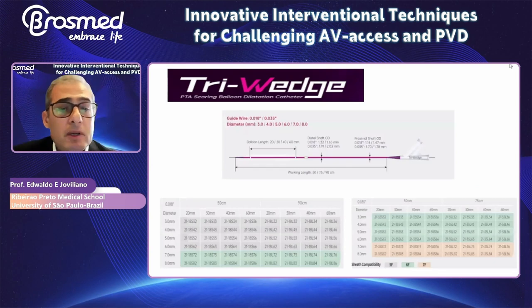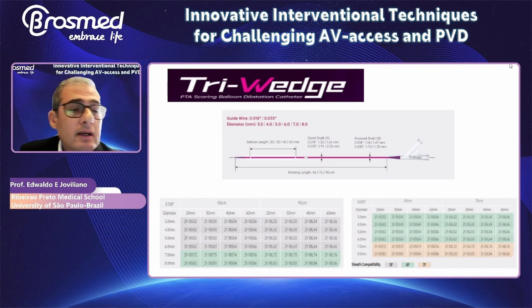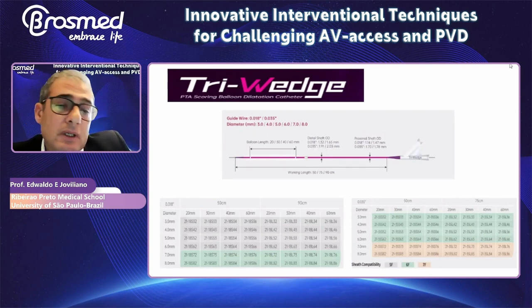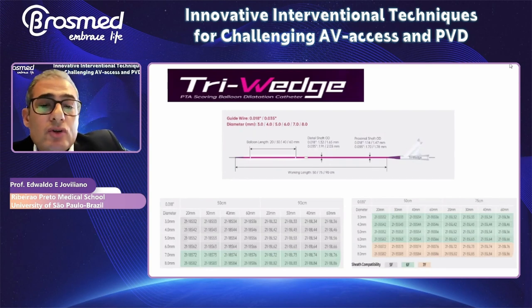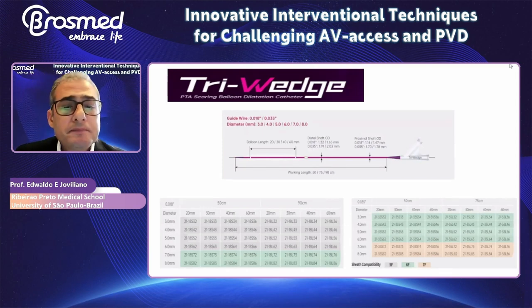This is the balloon. The working length can be 50, 75, or 90 centimeters, and the diameter ranges from 3 to 8 millimeters. Depending on the size of the balloon, you need a different sheath. The range will be from 5 French to 7 French.